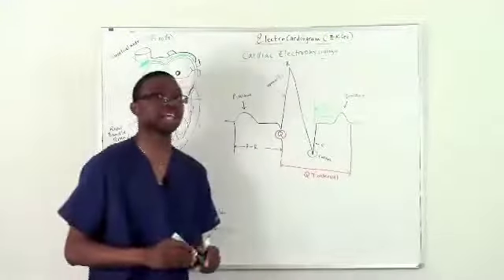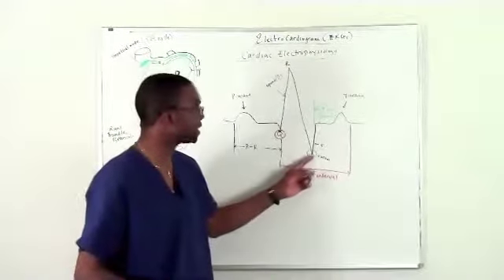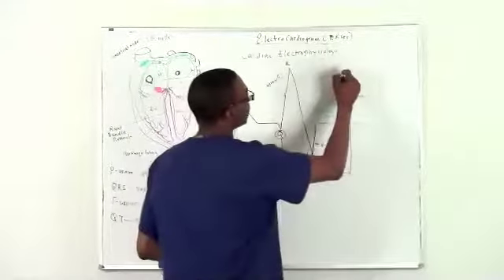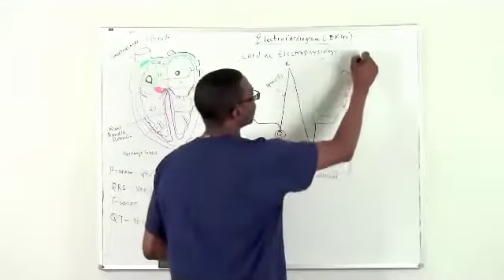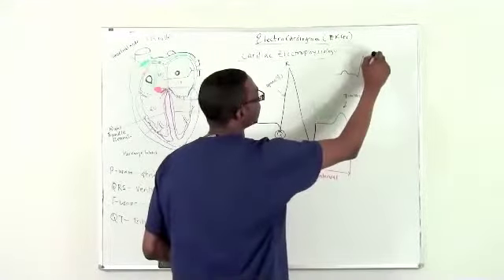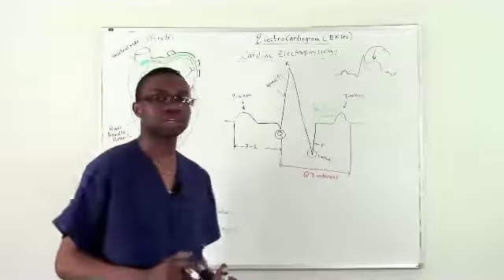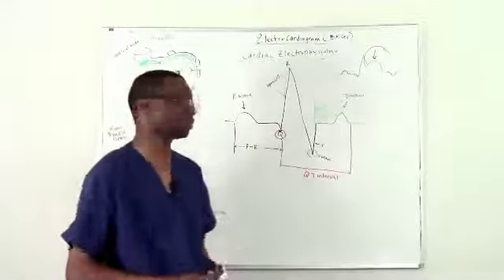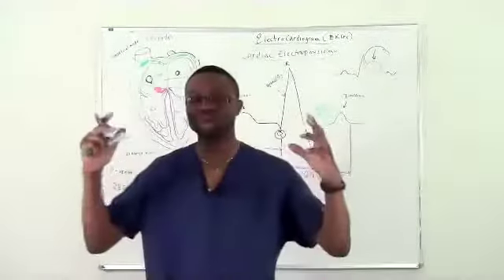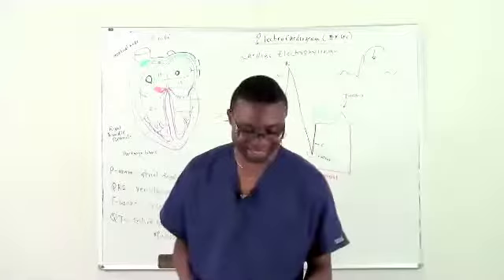And that is a very important segment when we're looking for acute myocardial infarction, when we say the patient has an ST elevation. And in that case, what you actually see, and this is just jumping the gun, but just to show you, see that? That is the ST elevation because this ST segment is elevated. And that is a sign of cardiac infarction, especially having 2 or 3 contiguous leads on the EKG. I know I'm jumping the gun, but I'm just trying to give you a broader perspective from physiology eventually to clinical medicine.